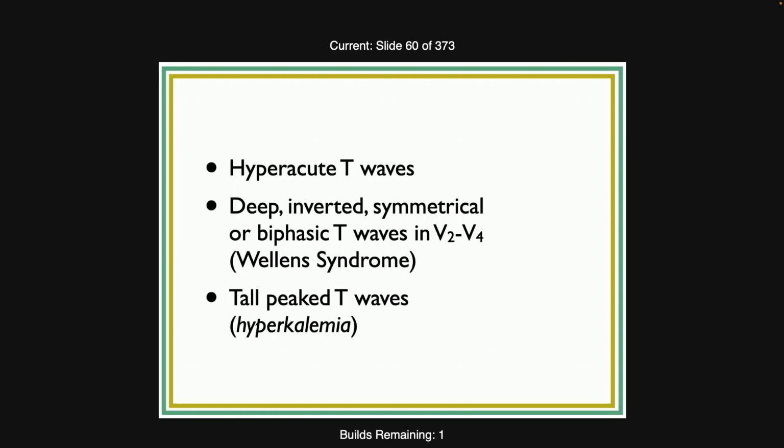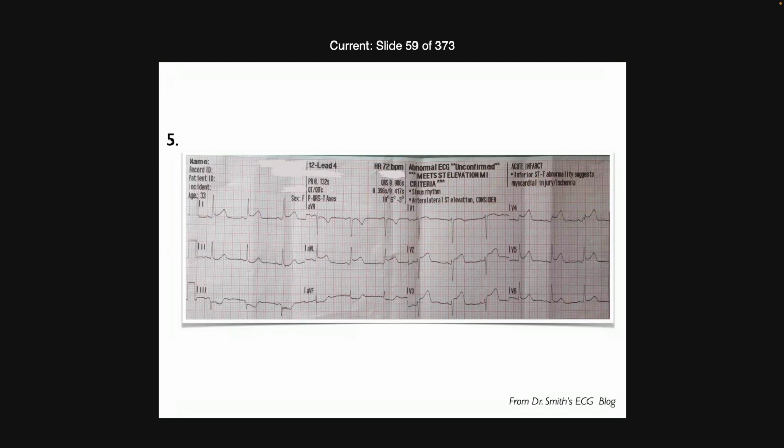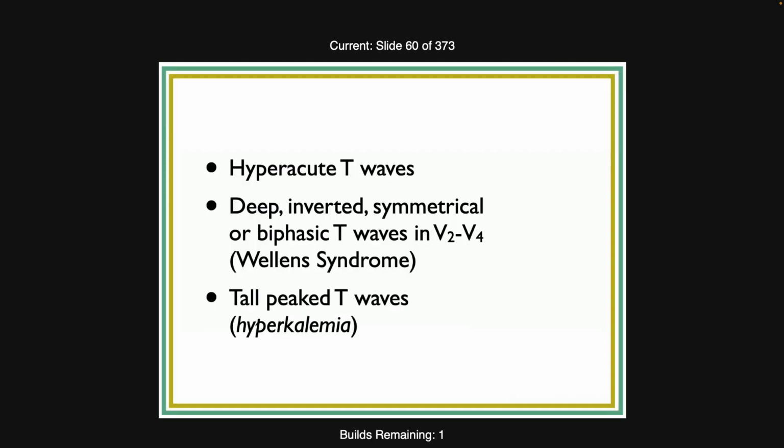Okay, so moving on. Any questions? What were the time intervals with all those? Unfortunately, I don't know except the first one to the last one was 20 minutes. That's all I know. To me, it's the best thing. I don't know why they X'd out the time. I guess they X'd it out so that you couldn't track it back to figure out who the patient was. So, it's too bad they didn't say, but 20 minutes start to finish.